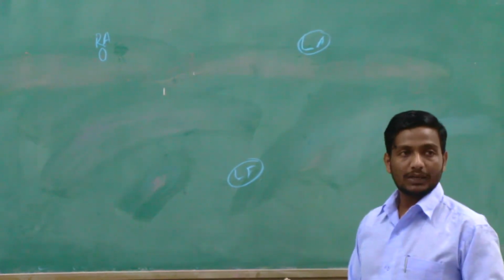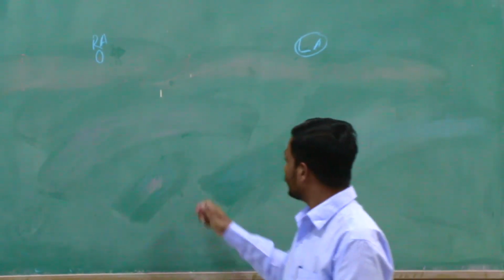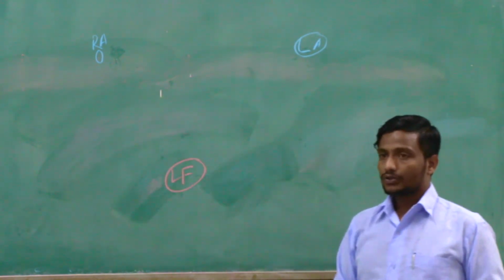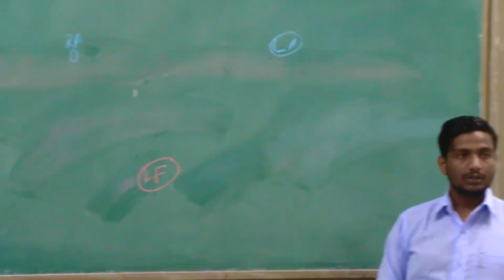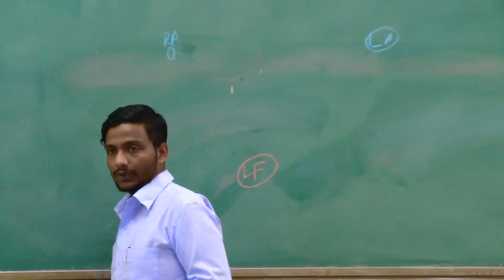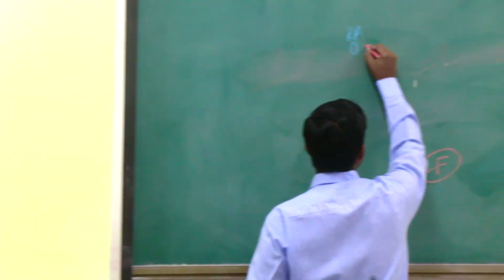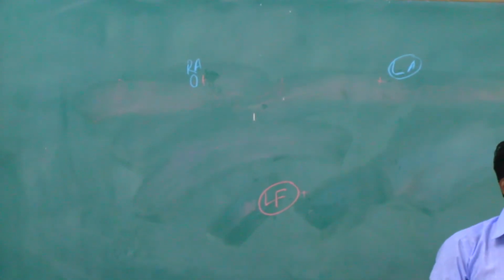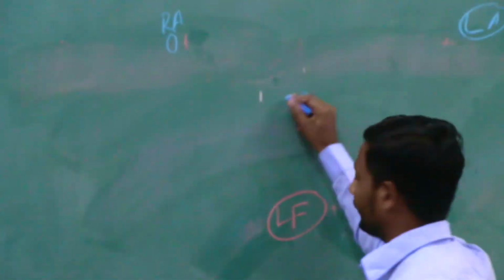Just to make it easy, I am going to put the left foot in the center. So this is the left leg or left foot electrode. Now we have 3 electrodes in the limbs which are going to show us the current. Now, you tell me the principle I told you: when these electrodes work alone, are they going to behave positive or negative? Positive. So they behave as positive, positive, and positive, and the center of the body behaves as negative.